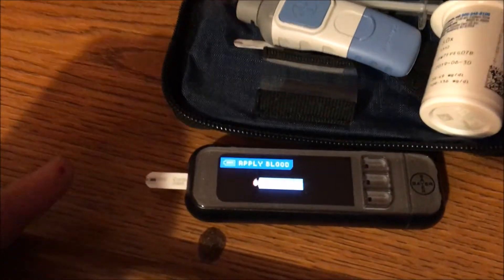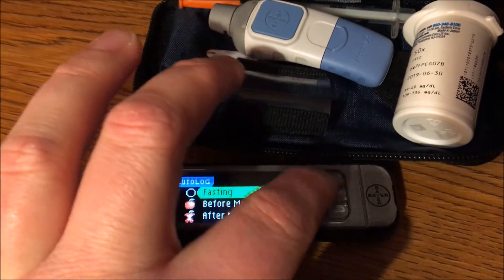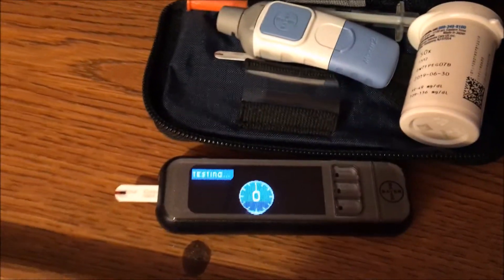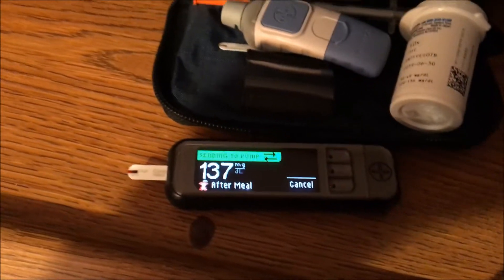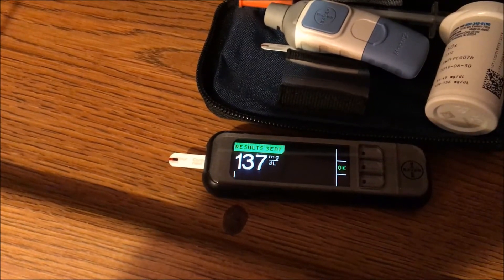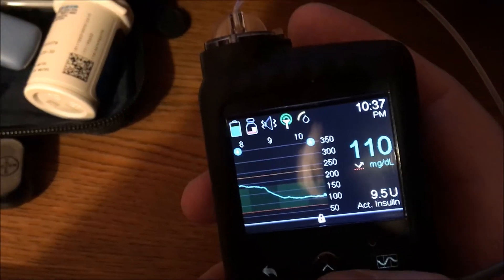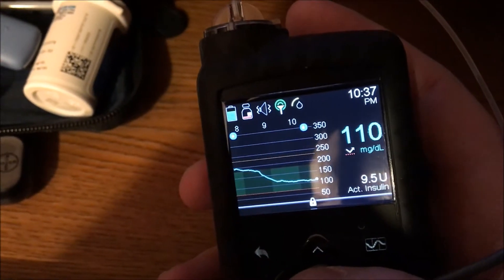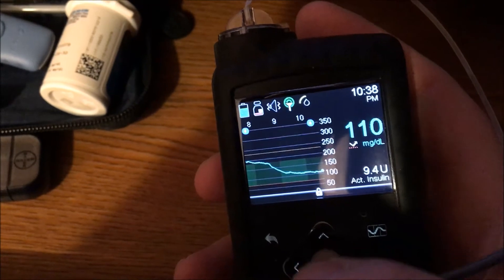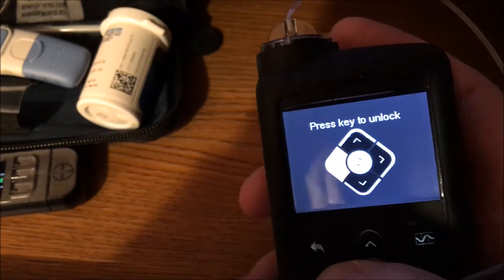Okay, so here we go. The result is 137. Interesting because the CGM says 110. That's actually kind of the furthest difference I've seen. Usually it's about 20-30 points. I've been pretty spot on — there was one time today it was 157 according to the CGM so my meter said 154. So I'm kind of surprised by this one.